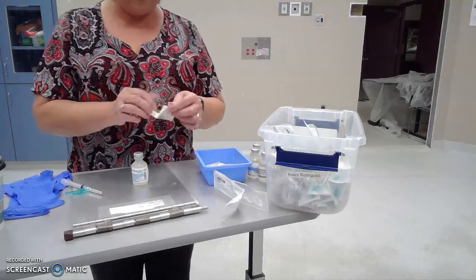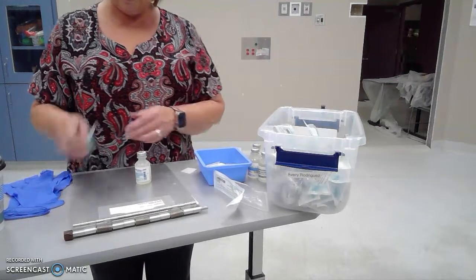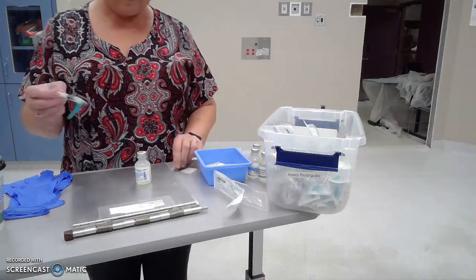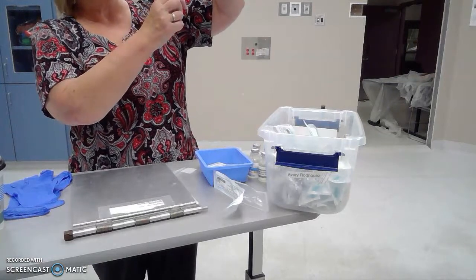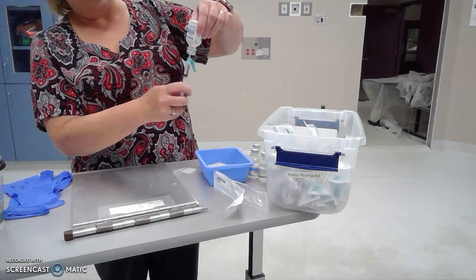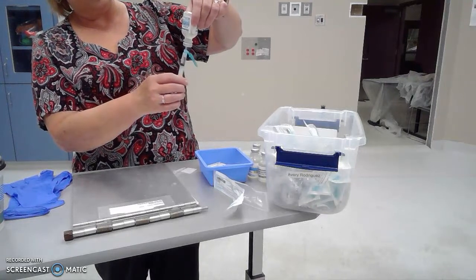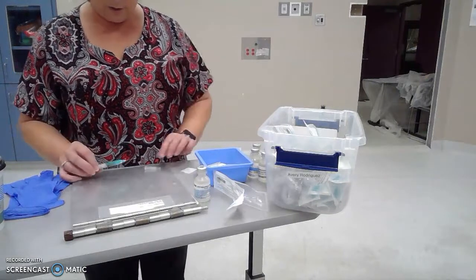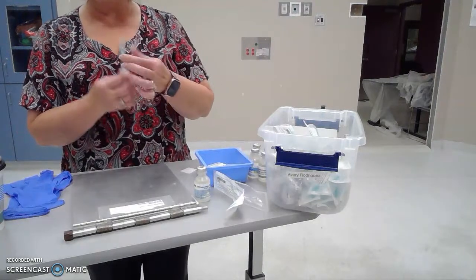I'm going to get an alcohol wipe, clean the top. I'm going to put in 1 milliliter of air. Then I'm going to flip over, push that up. I'm going to pull down and push back up to 1 milliliter. Make sure I don't have any air bubbles. Pull that out. I'm going to use the scoop method to put my cap back on my needle because I have to take this to the patient room.